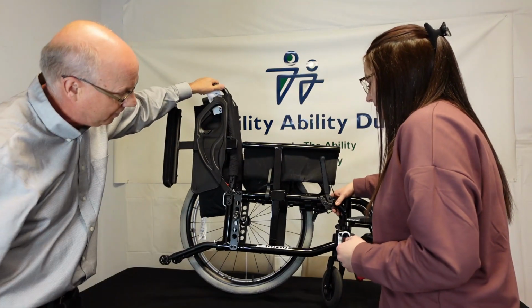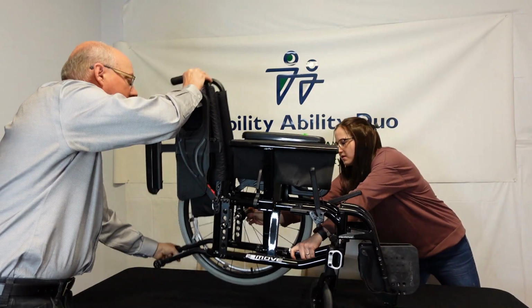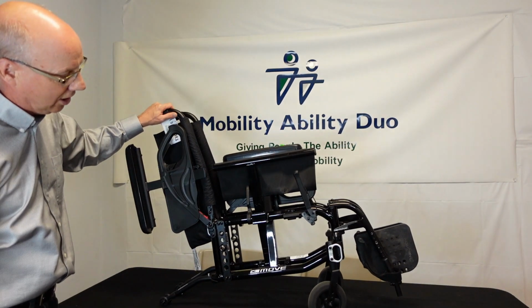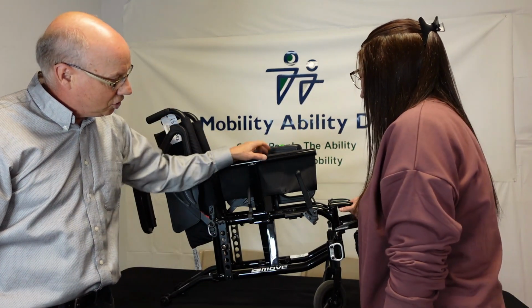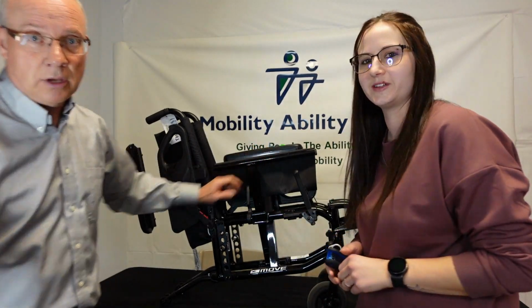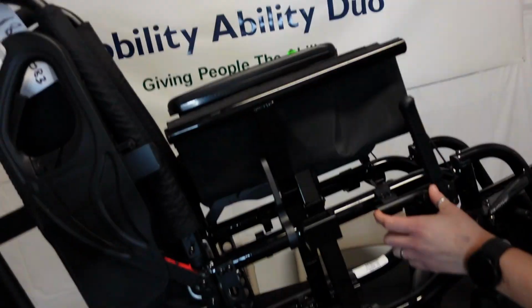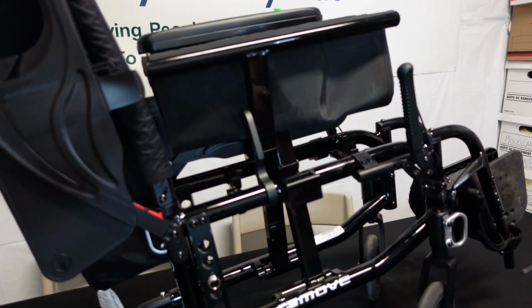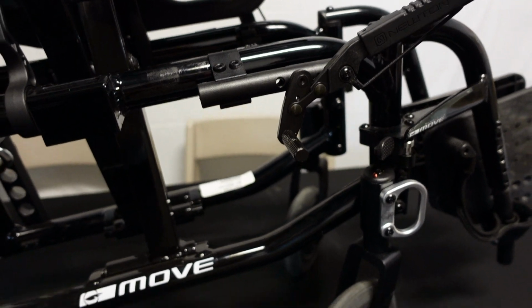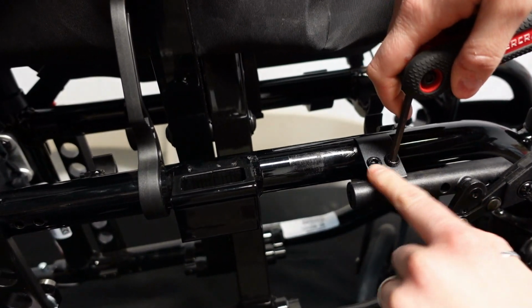So we'll take the wheels off, the other one too. Now you can see it a little bit better. We grab the camera and get a closer look. Let's zoom in a little bit, so we can show what the brakes look like beforehand. You've got the brakes over here, and you've got the bolts up top. These are the ones we're going to adjust right here.